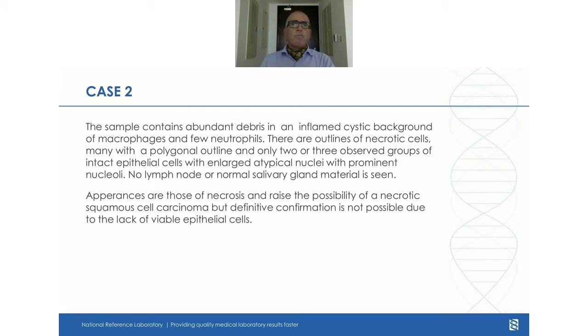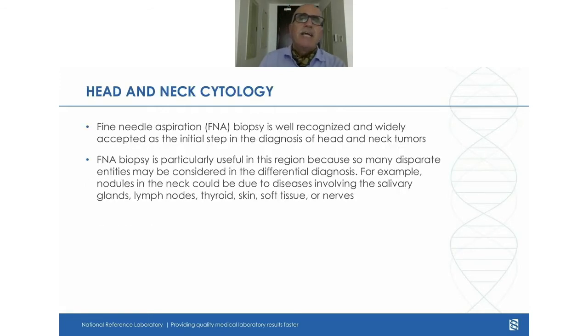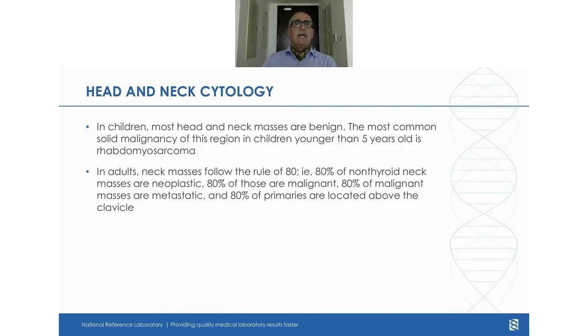So this is the issue with cystic lesions. You know, when you FNA a lesion in the head and neck, sometimes you don't really know what you're dealing with from the start. And that is why communication with the clinician is absolutely essential and paramount. I'll never stop saying that to my residents. And it is, of course, pretty useful. It can even be thyroid in some cases.